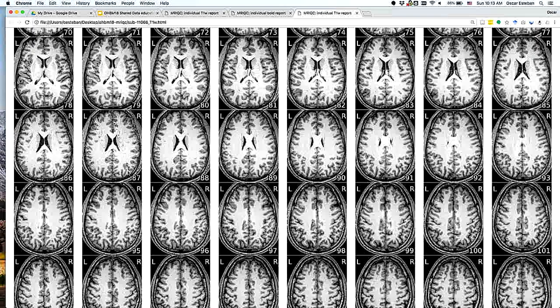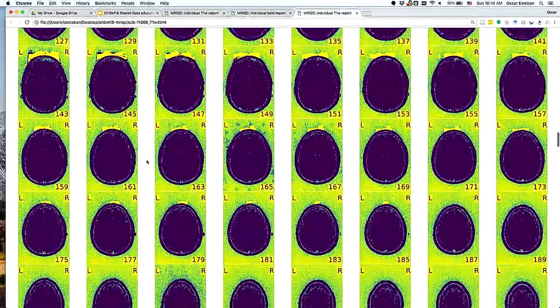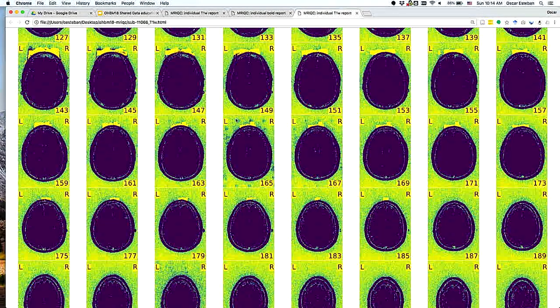If you open it up on your screens, you will see at this axial view of the dataset a very weird pattern. There was a hardware failure here, and this will totally confuse FreeSurfer or any other tool you use for structural analysis. I actually think you can also see in the background these little dots. Those are like stripes. You would see them in the original image, and this was a funny problem I found.